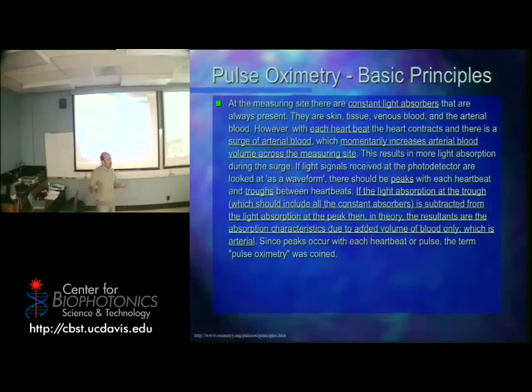How did they originally calibrate this system? The volunteer, aka sucker, was there with a device on their finger measuring the light constantly, and on the other side somebody was taking their blood, right? Or it might have even been from the same hand.